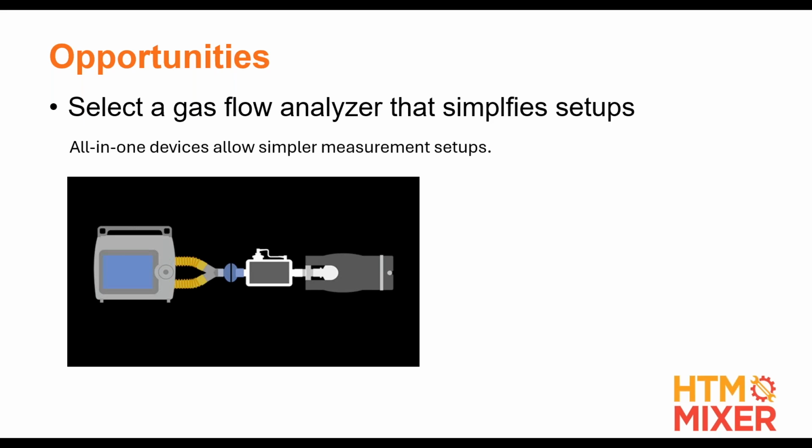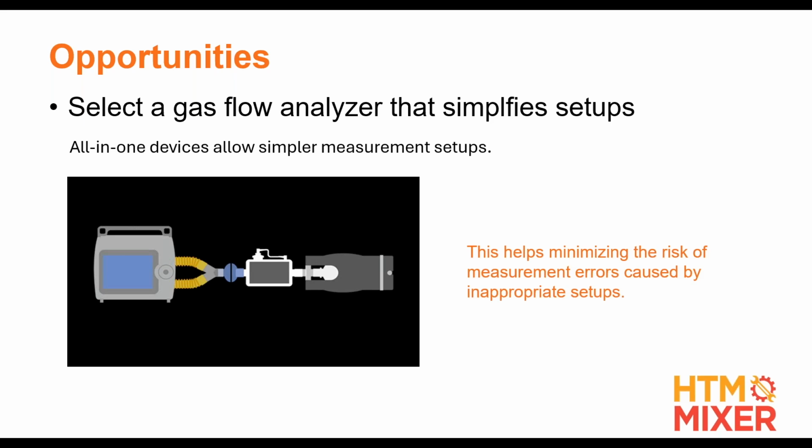These are often called all-in-one devices, and this is just one example. There are others out there. But that's what a lot of the newer ones are going to, a single channel to do almost all of your measurements. Okay. And what that does, of course, is help to minimize errors that are caused by setups that might be done incorrectly. Any questions so far?